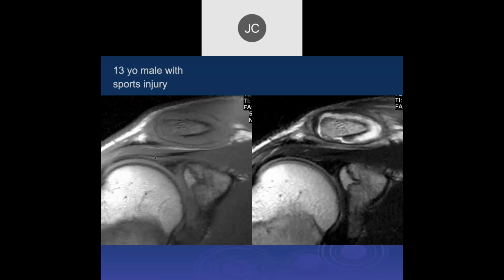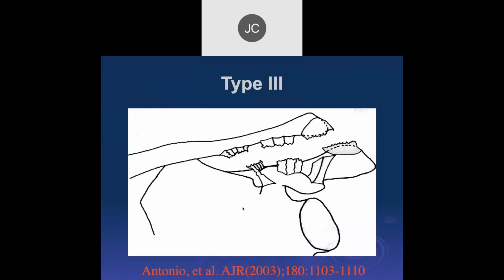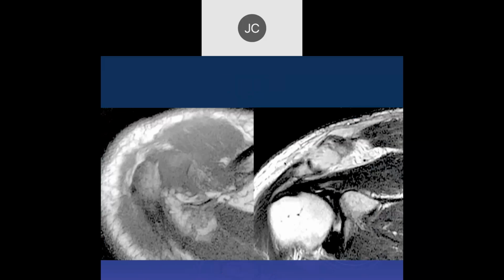Okay, Ivan, you next? All right. Now we have a 13-year-old male with a sports injury. Surrounding that AC joint, it looks like there's a lot of edema fluid. You're right, distal clavicle. Here, it looks like there's a tear of the coracoclavicular ligaments. Well, there's edema in it. It looks to me like there are still fibers intact, so I think this is a type 2, where you have a rupture of the AC capsule and a strain, but not a complete tear of the CC ligaments. And then we can move to type 3, where you have tears of both of those.